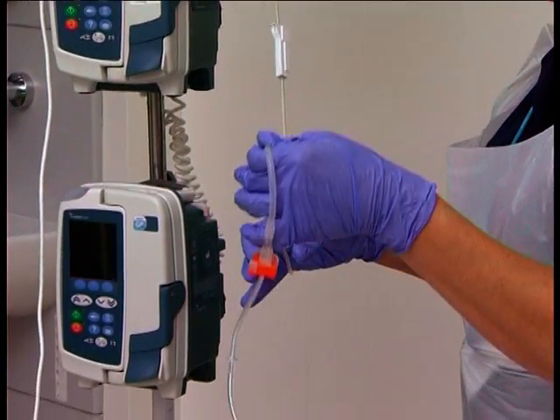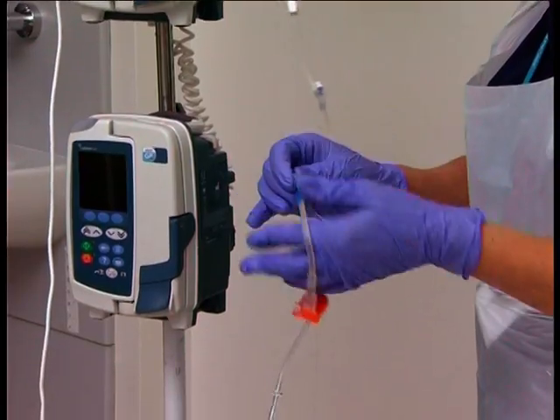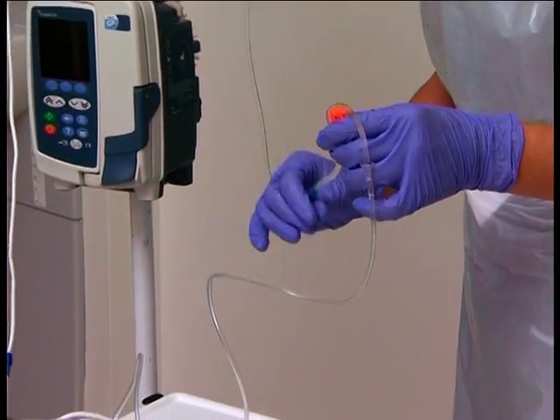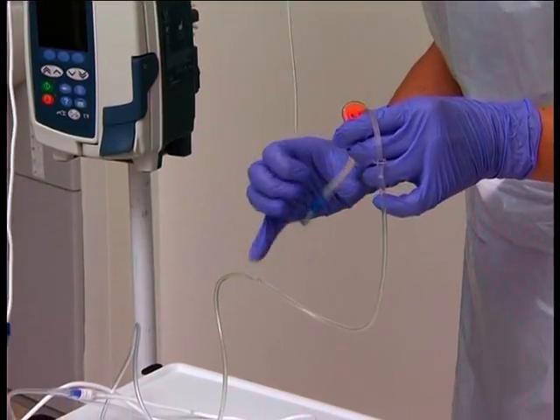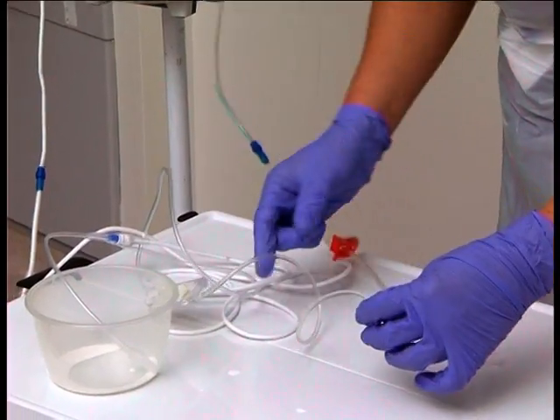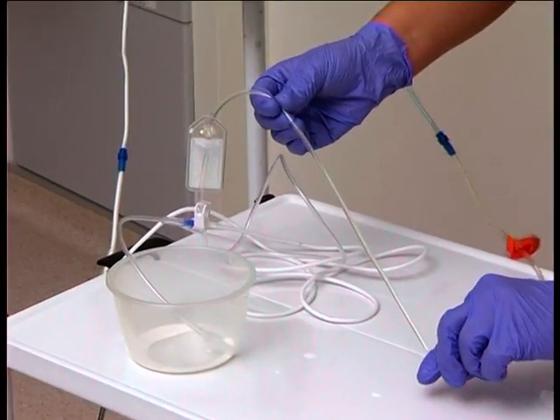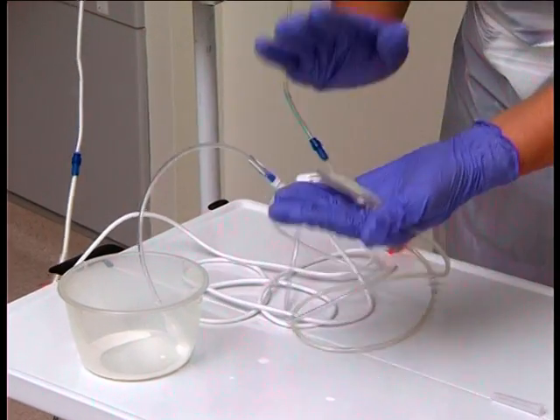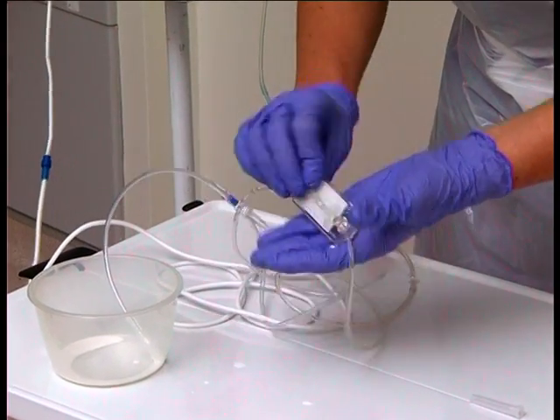Continue along the set and expel any air by allowing it to run upwards in the direction that the fluid is travelling. As the fluid fills the filter, tap it in the palm of your hand to expel air.